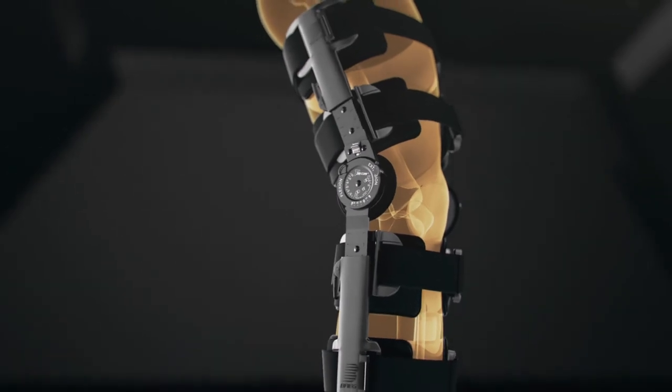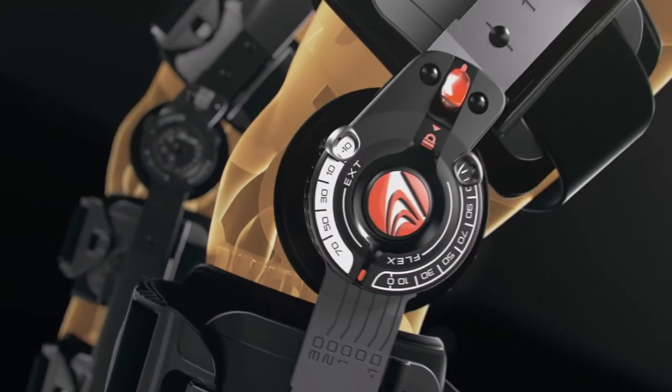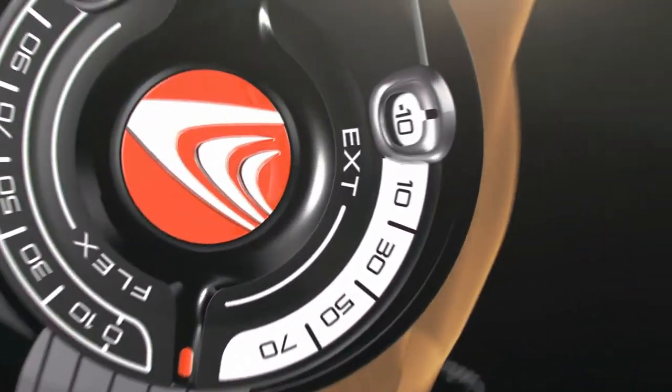First, there was T-Scope, one of the most trusted post-op knee braces. Now there is T-Scope Premier, the evolution of post-op bracing comfort, simplicity and performance.